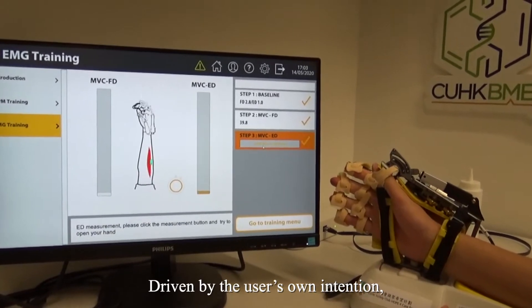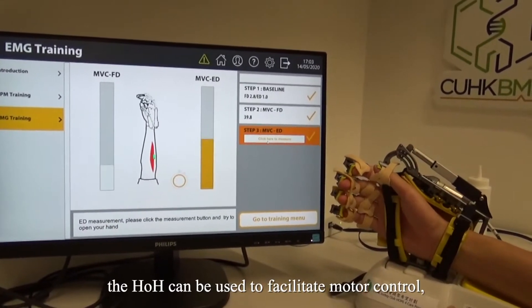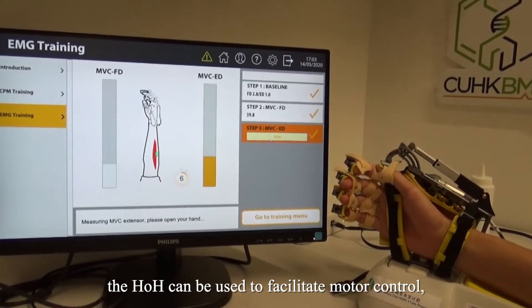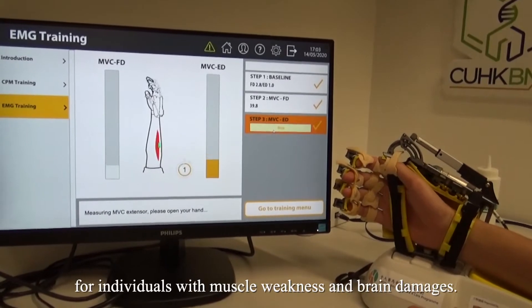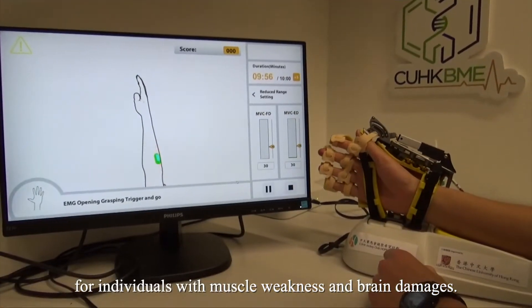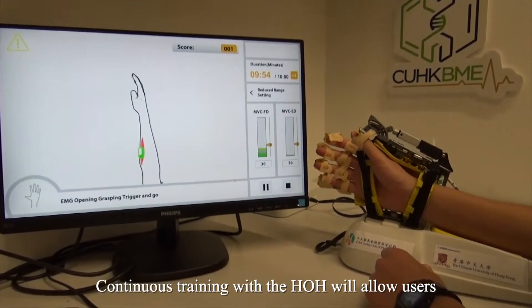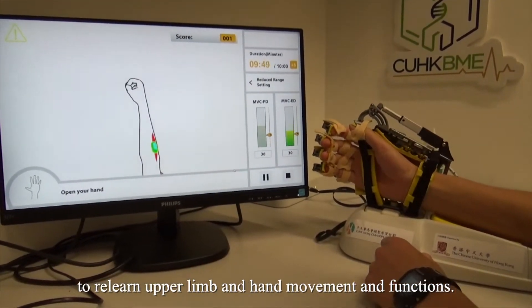The motion is driven by the user's own intention. It can be used to facilitate motor control, coordination, and muscle relaxation for individuals with muscle weakness and brain damage. Continuous training will allow users to relearn upper limb and hand movements and functions.